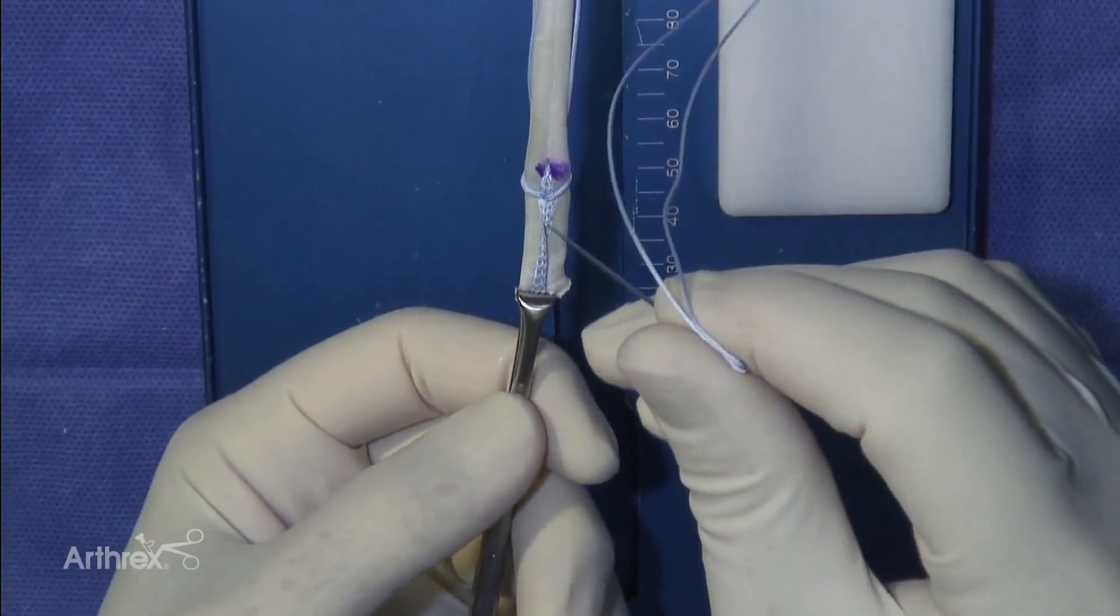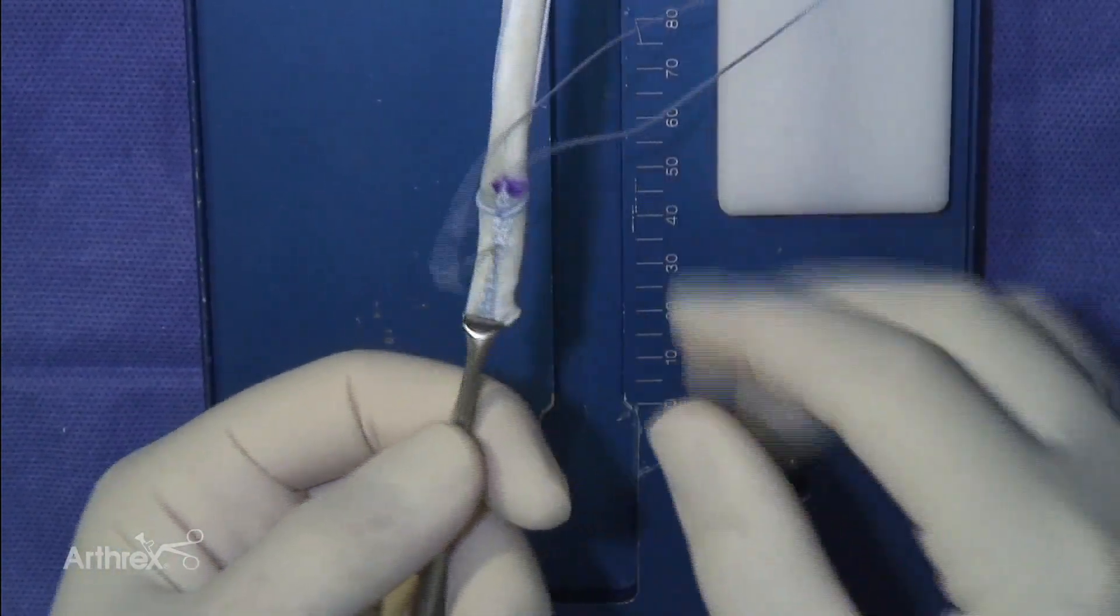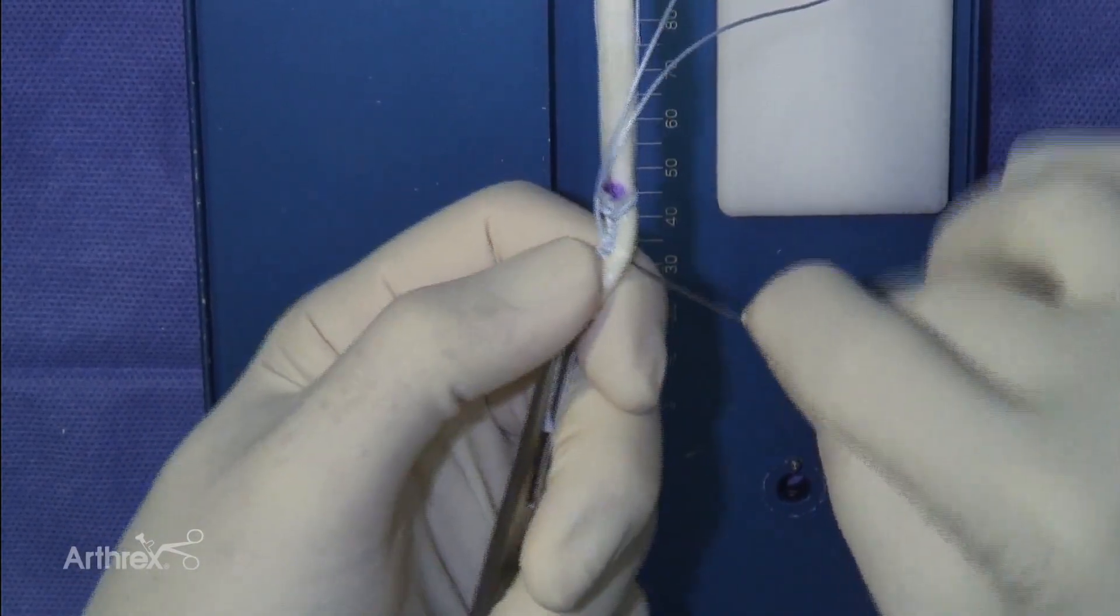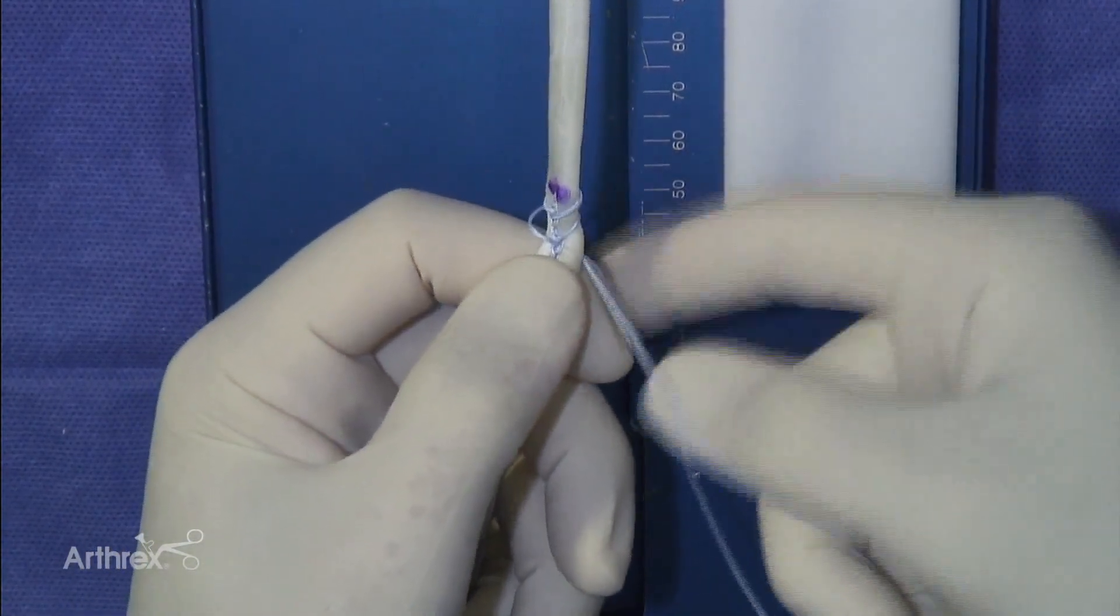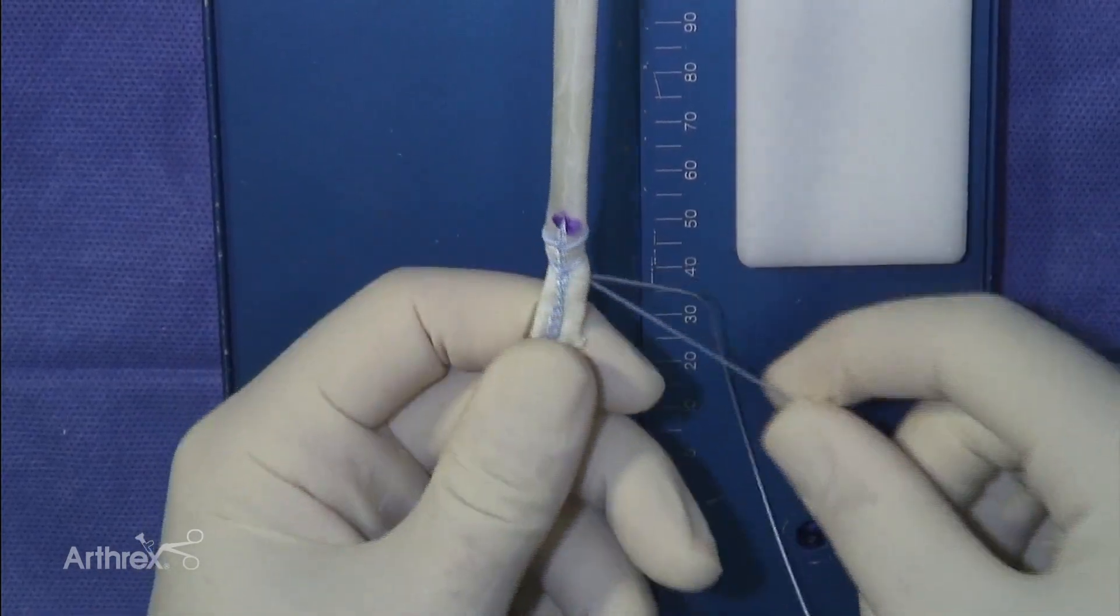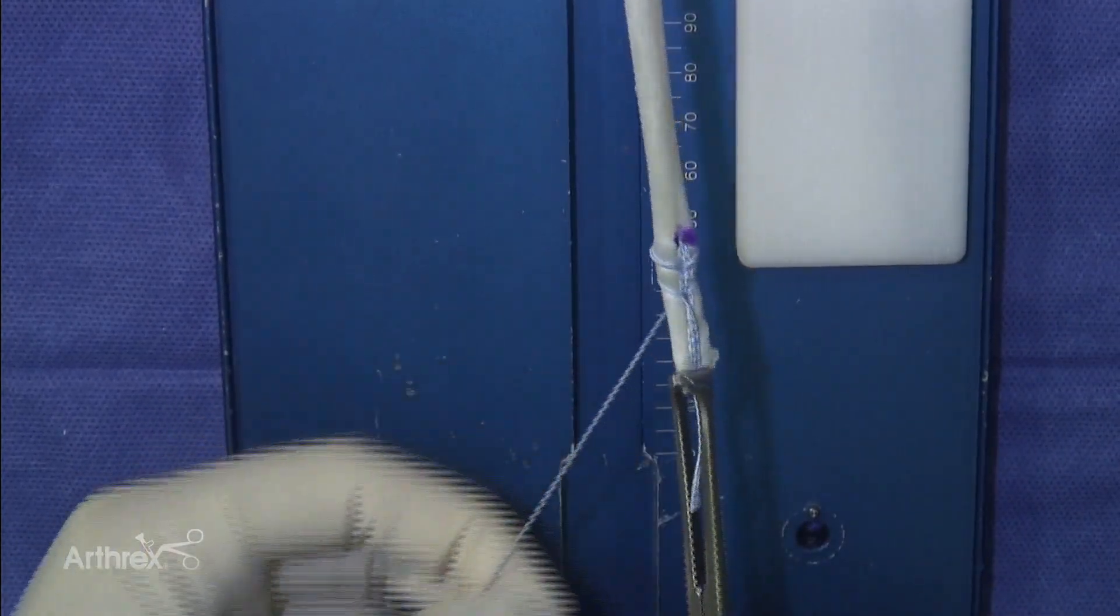Repeat the stitch pattern by again spreading out the limbs of the fiber loop and passing the needle through the fiber tag and graft distal to the previous stitch. Pull each strand of the fiber loop suture firmly again to tension the stitch.